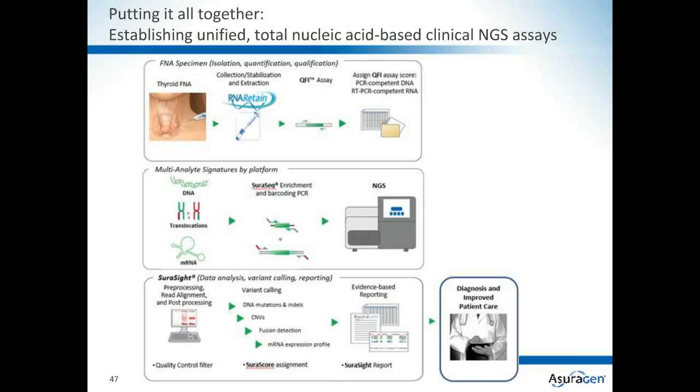So that's another innovative feature of this particular case study, and that is that it taps into multi-purpose clinical content. Not just diagnosis of malignancy, but also markers that can have informative insight into uptake of radioactive iodine for patients with thyroid cancer, for potential prognostic implications for these patients, for targeted therapy and theranostics, etc.